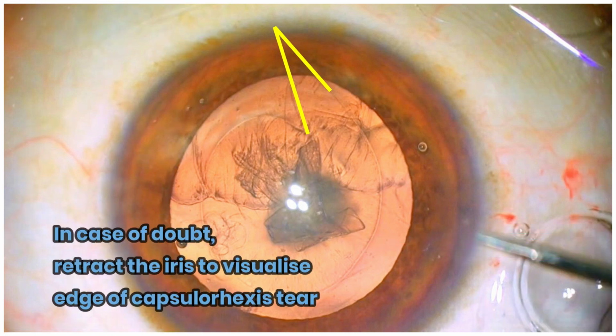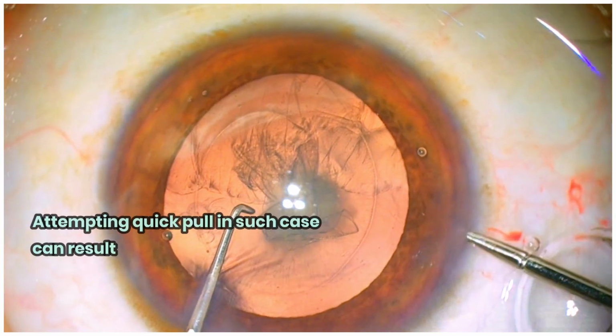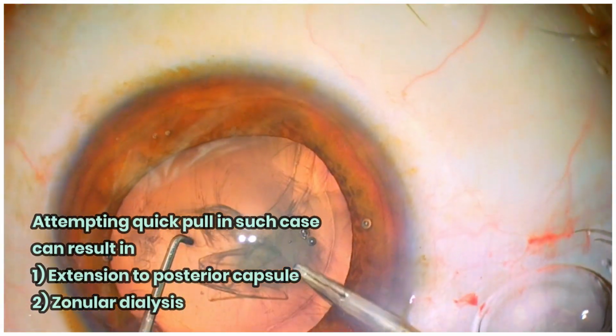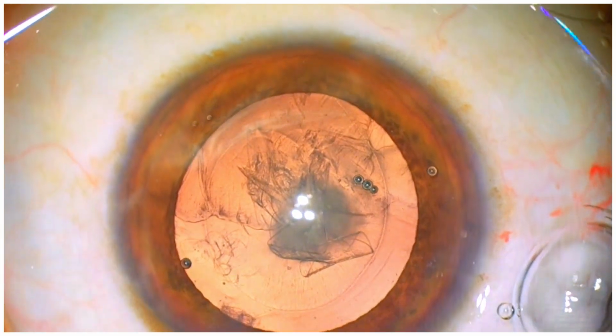In case of doubt, you can also retract the iris to visualize the edge of the capsulorhexis tear. If it has already reached the lens edge, avoid, because attempting quick pull in such case can result in extension to the posterior capsule or zonular dialysis.